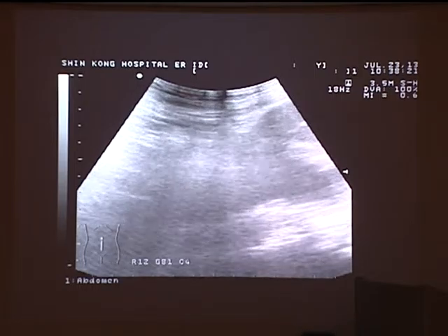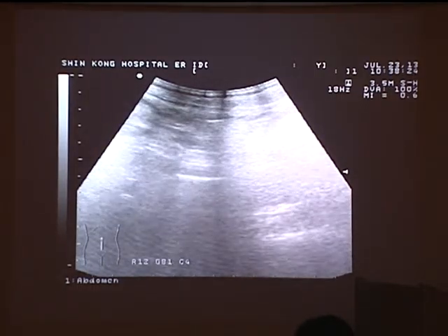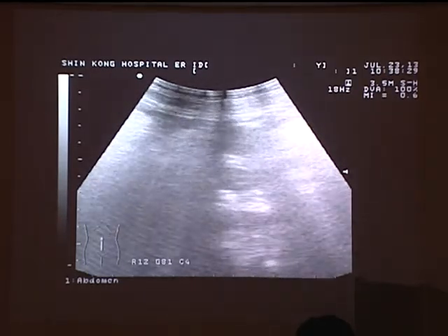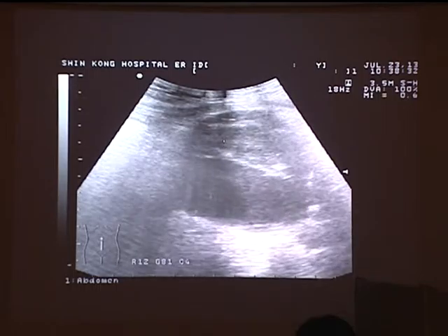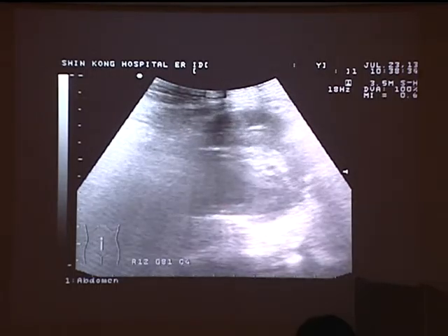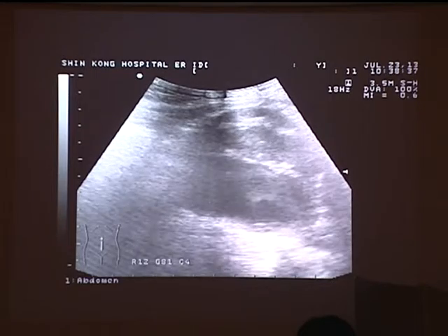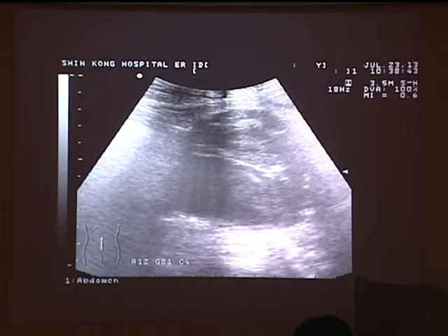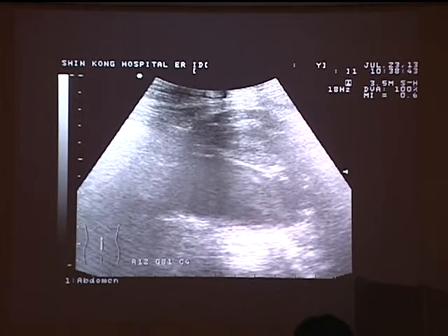As you can see, there is a big abdominal aortic aneurysm in his abdomen, and there's some thrombosis of the aortic wall, like this, and turbulent flow in the aorta. He had no symptoms, right? But maybe he will die tomorrow due to a ruptured aortic aneurysm. So screening for aortic aneurysm is quite important, because this kind of patient may not have any symptoms until they are dead.